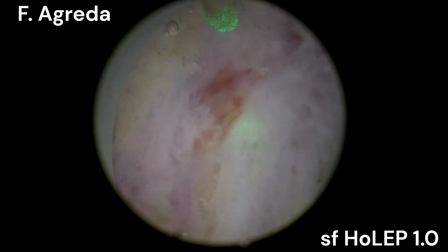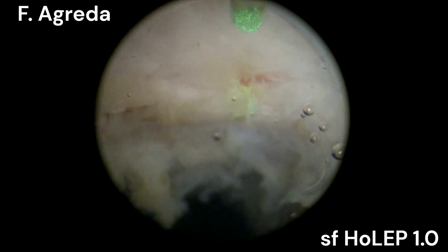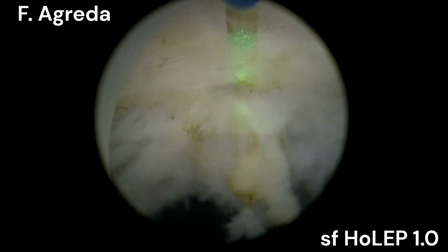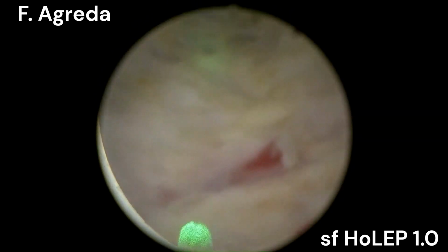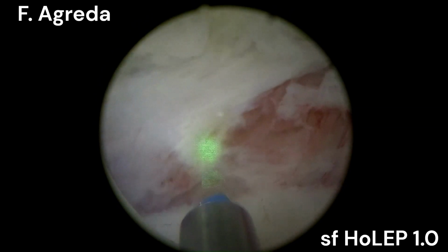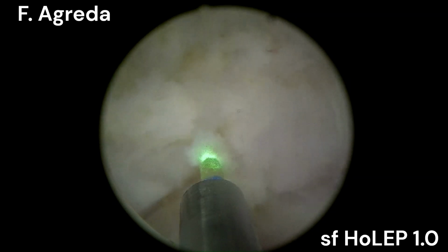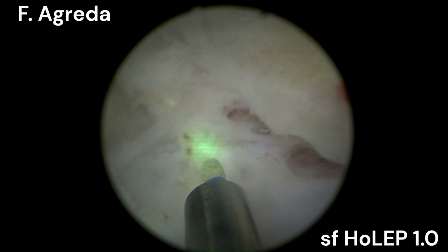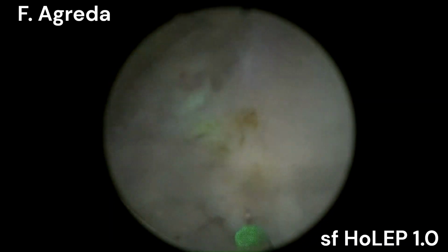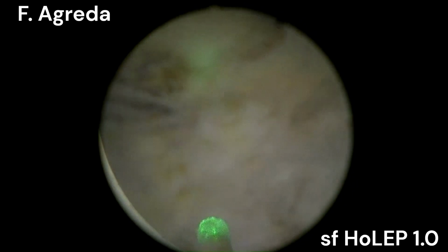As you can see here, there's no bleeding. There's some very thin part of the capsular fibers. As you can see, there are almost no bleeders at all when I'm finishing this process. So I'll do some extra hemostasis for my own peace of mind. There probably won't be any damage or any bleeding problem in the next hours. This patient will be on bladder irrigation for 1 hour, a couple more hours of observation, and then will go home with a bladder catheter to be removed the next day by the nurse.